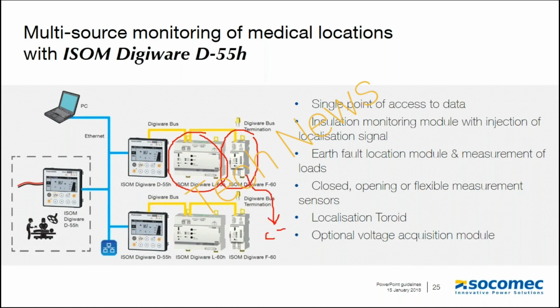Okay, and everything is connected to the D55H, which is the remote, which acts as a display as well as a remote annunciator.